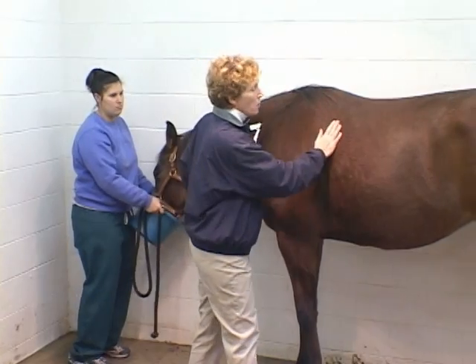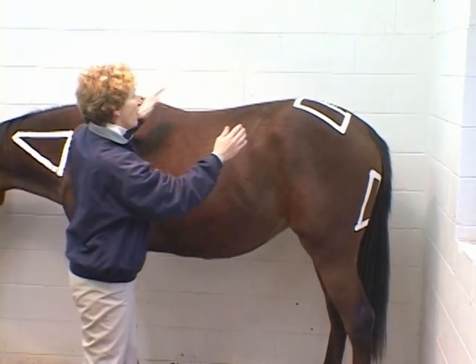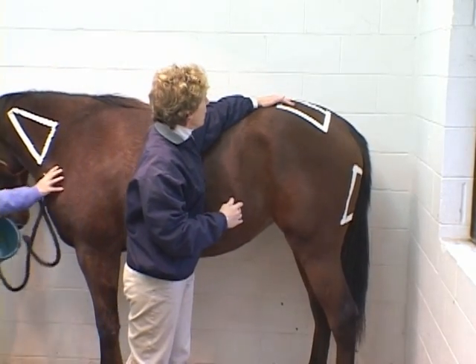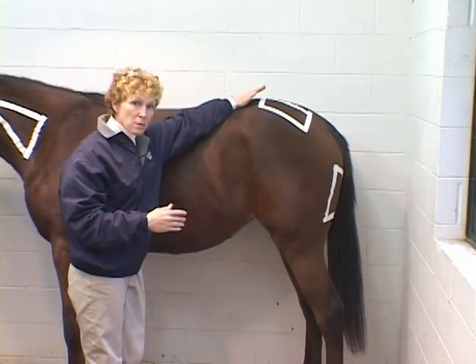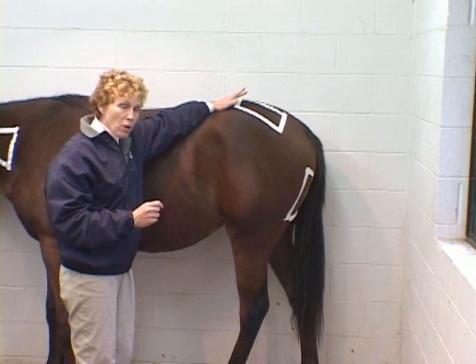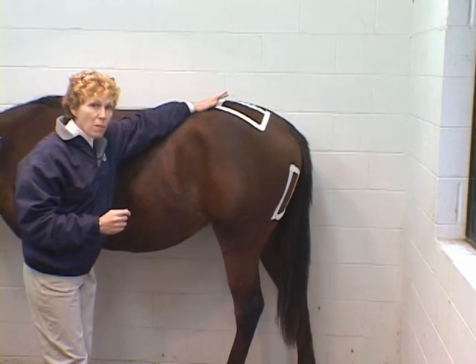One of the other major muscle masses that we use is the gluteals, right up here on the top of the rear end. The good news about this location is it's a major muscle mass — you've got lots of place to put it. The bad news is that, first of all, you're at her rear end, and second of all, if you started to have a vaccination reaction or an abscess, you have very bad drainage there.